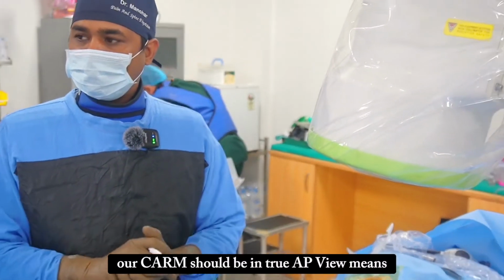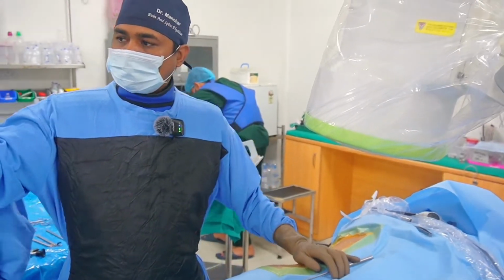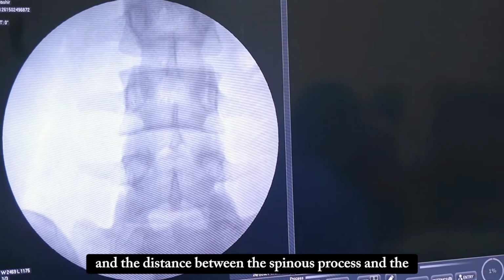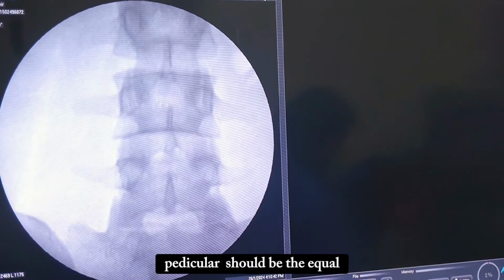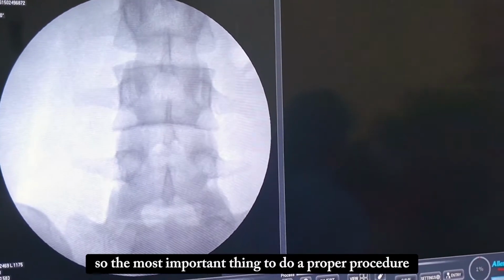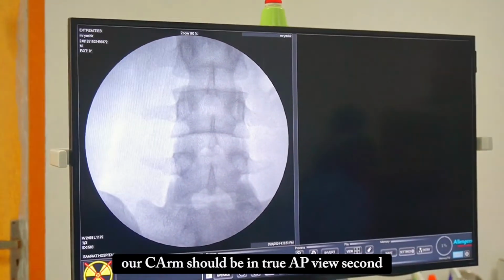Our C-arm should be in a true AP view. True AP view means the end plates of the related vertebra should be parallel, and the distance between the spinous process and the pedicles should be equal. So the most important thing to do a proper procedure is that our C-arm should be in true AP view.